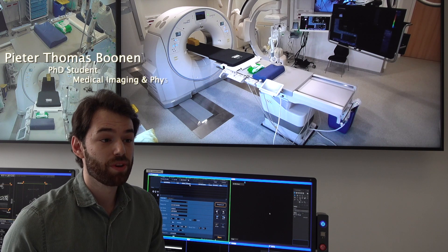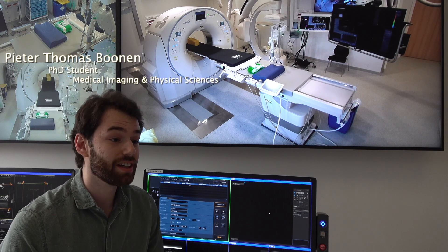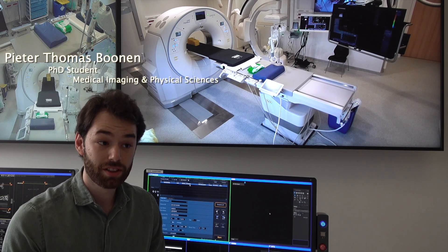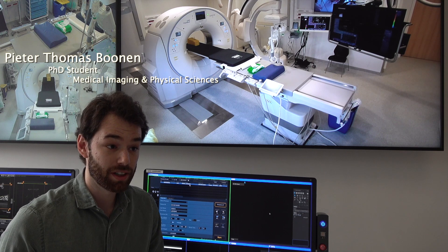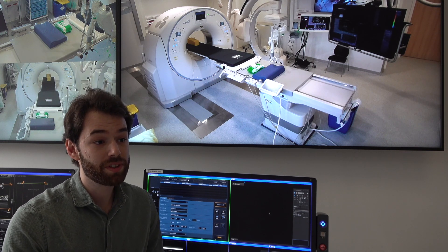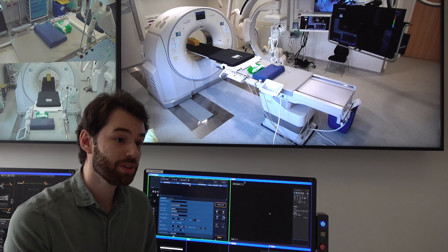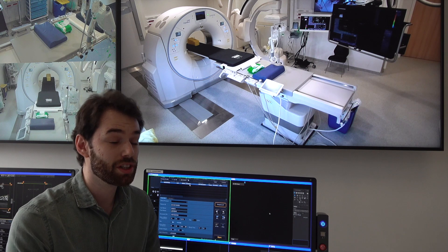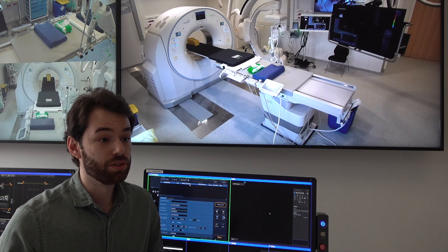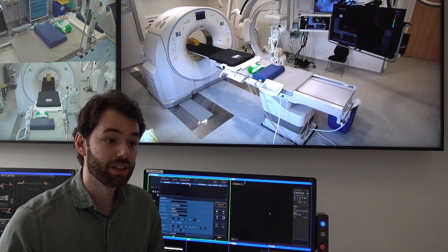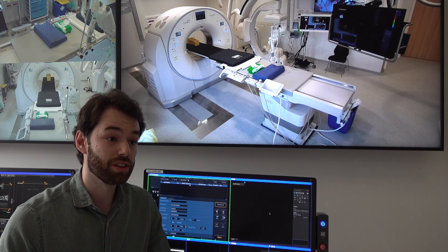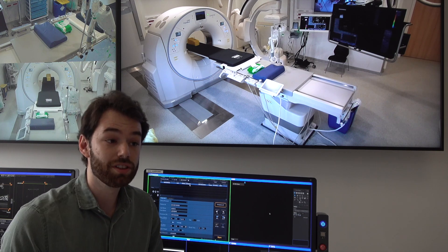Because you start out with at least 30,000 images with the added four-dimensional temporal aspects, all of these images have to be processed to obtain the essential hemodynamic information as well as the vascular structure, to end up with an image that is easy for the vascular surgeon and the radiologist to comprehend.